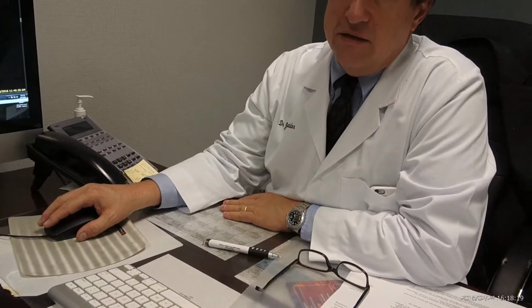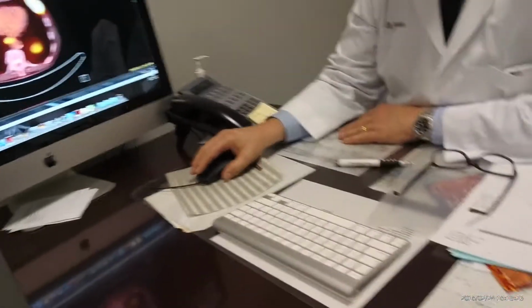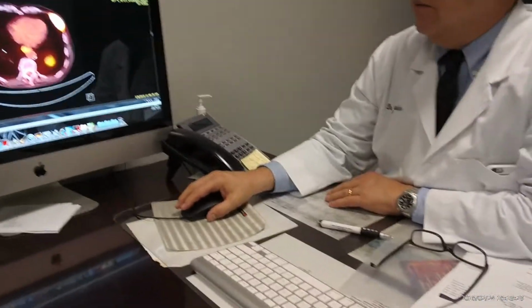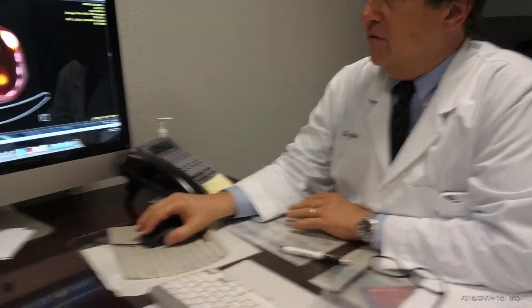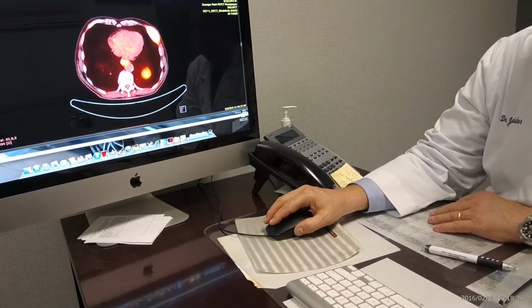And this may unfortunately represent bony metastasis. Did you fall or hurt yourself in any way on that? I did. I didn't fall. I smashed into a piece of equipment on my job. That's right. But that goes back to September. Probably unlikely related to anything you did, unfortunately, because this is a rather significant glow, as you can see.